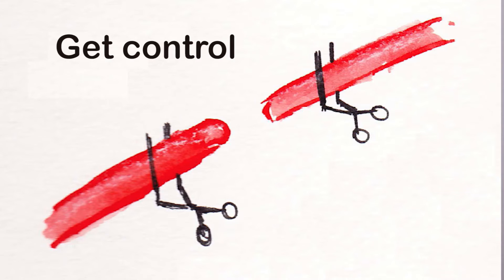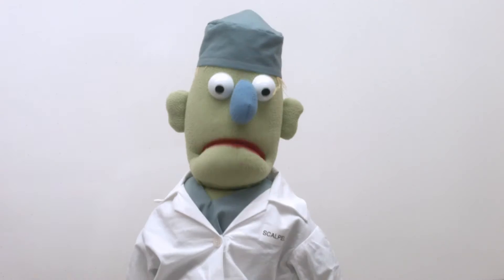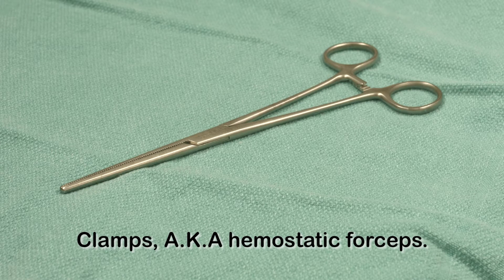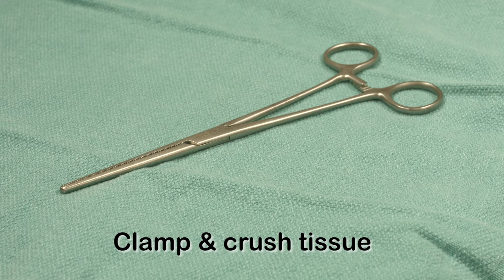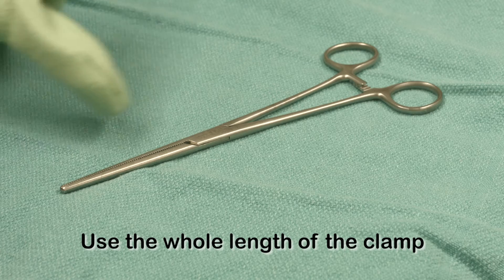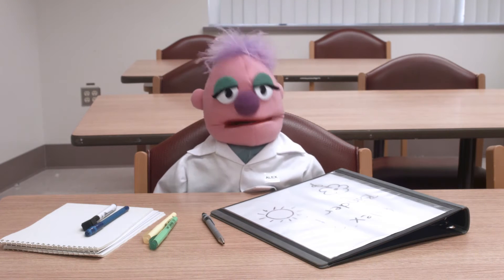You have to get control and then ligate the vessel — figure out what vessel it is and what it's supplying. Now let's talk about how we use clamps to control blood vessels. Clamps, or hemostatic forceps, are a kind of tissue forcep. Just like other tissue forceps, they look a bit like scissors. We use them to clamp and crush tissue in preparation for tying it off. The main difference is when you're using tissue forceps, you're just grabbing tissues with the tip, but when you're using a clamp, you're using the whole length of the instrument to crush the vessel.